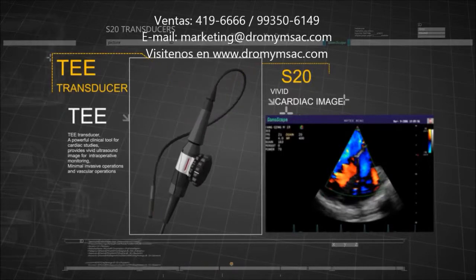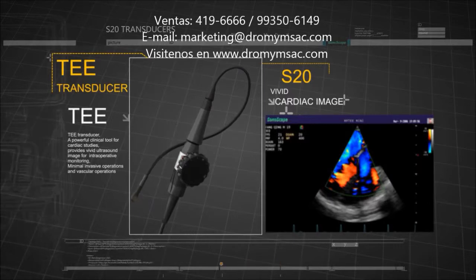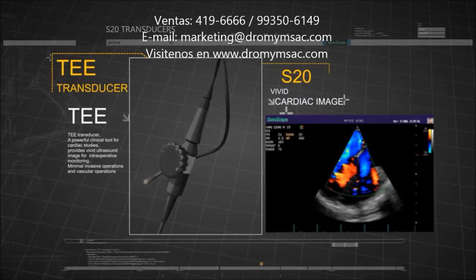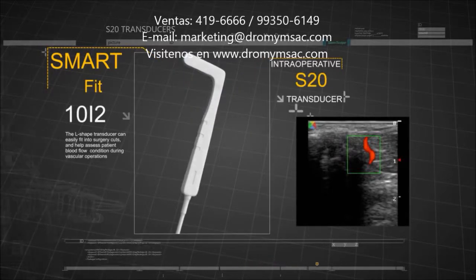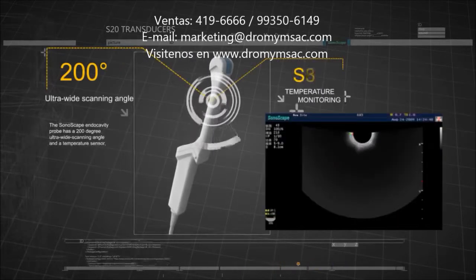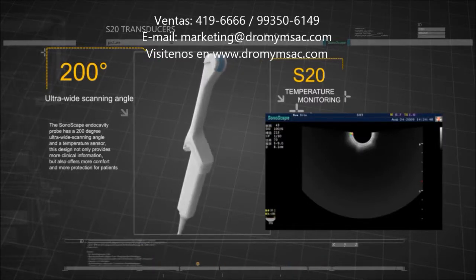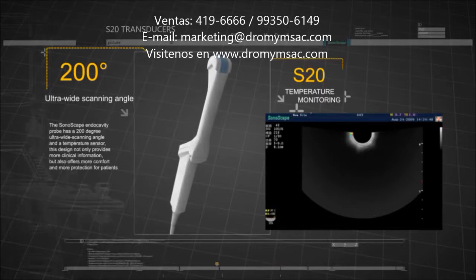The TEE transducer provides vivid ultrasound images for intraoperative monitoring, minimal invasive operations, and vascular operations. The L-shaped transducer can easily fit into surgery cuts and help assess patient blood flow condition during operations. The Sonoscape endo-cavity probe has a 200-degree ultra-wide scanning angle and a temperature sensor, providing more clinical information, more comfort, and more protection for patients.